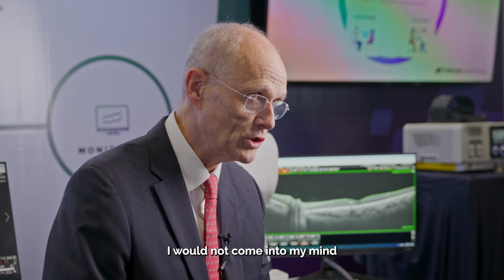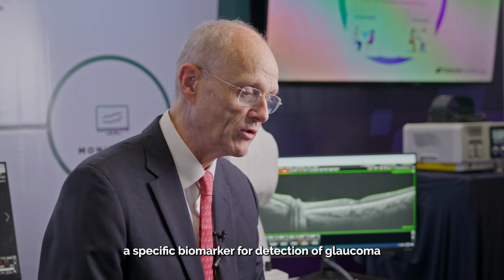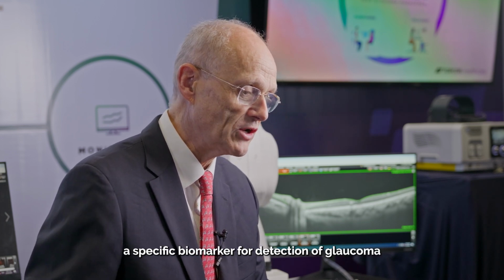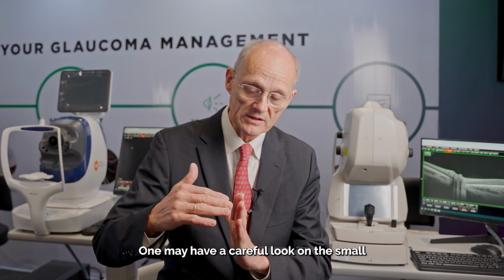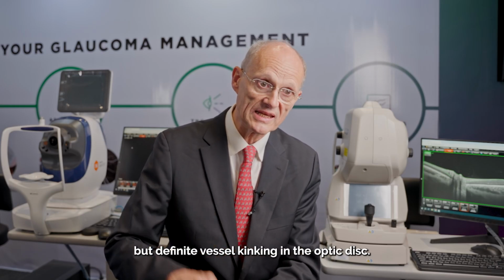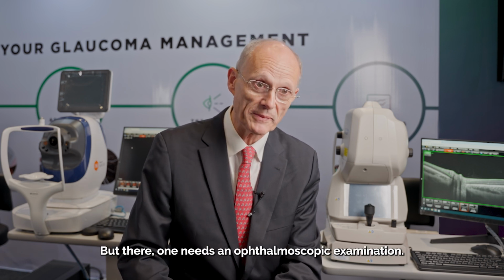At the moment, I cannot think of a specific biomarker for detection of glaucoma in moderate or high myopia. One may have a careful look at the small but definite vessel kinking in the optic disc, but there one needs an ophthalmoscopic examination.